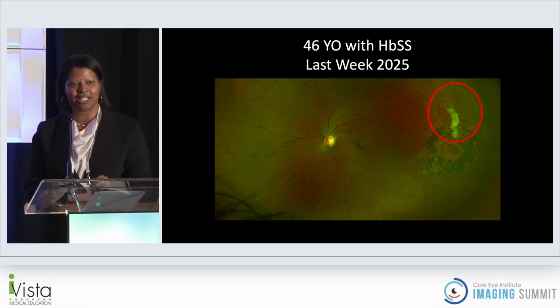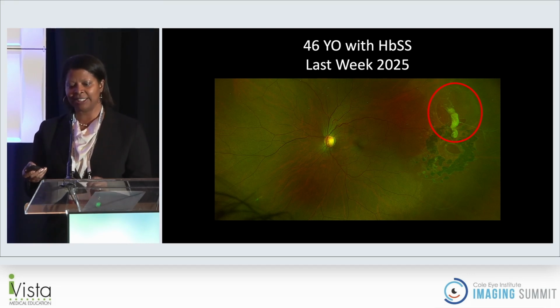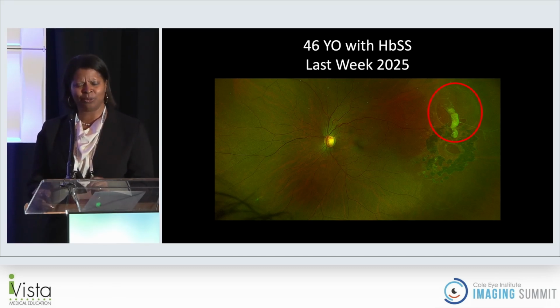But sure enough, he had serial fundus images that really helped to see, no, this was new. And there's a horseshoe tear, that area of the neovascularization definitely pulled a break in the peripheral retina. And just a little clinical pearl, again, where the retina is ischemic, you're going to have very fragile retina. So I'm actually quite worried about this individual.